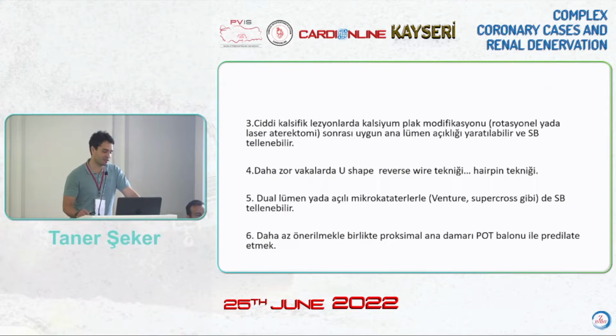For the serious calcific lesions, sometimes there might be plaques that prevent the wiring of the side branch. Then after plaque modification or clearing the calcification, adequate main lumen clearance can be created, and then the side branch can be wired. In challenging cases, the U-shaped reverse wire technique or hairpin technique can be adopted. With dual lumen or angled microcatheters, the side branch can be wired. But this is the last stage.